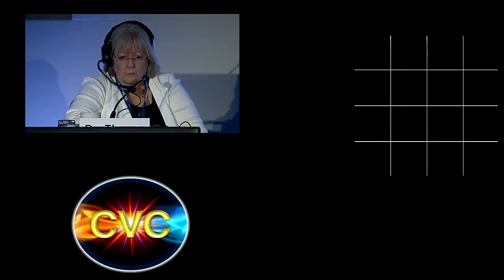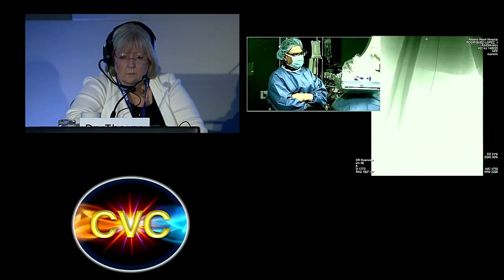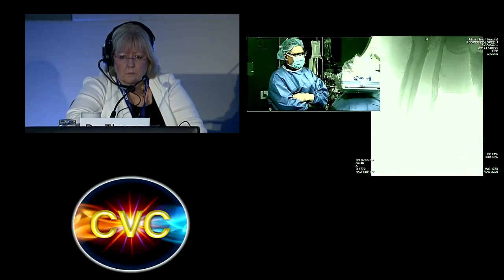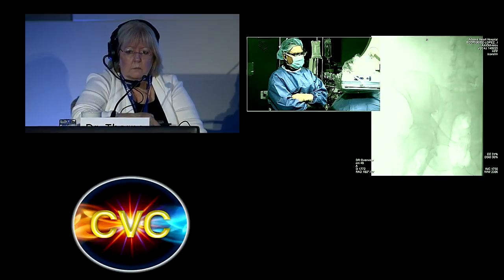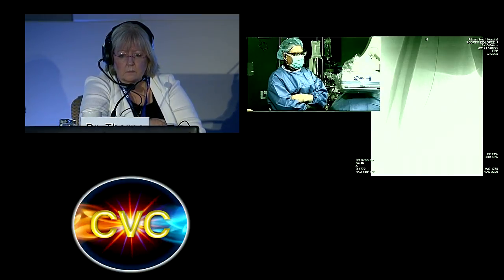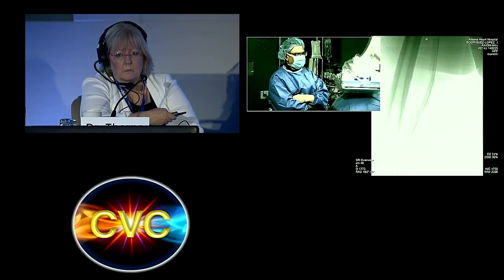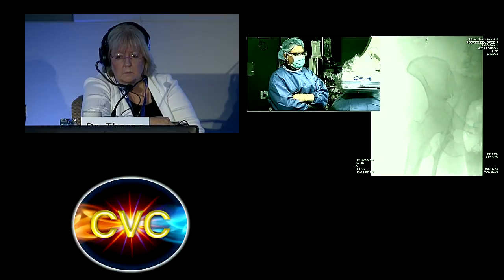While we were waiting here, I decided to do an angiogram. If we can show you the first picture coming up from the popliteal, it's nice to see that the femoral vein actually is well recanalized. And you can see some of the valve is still there with some of the branches and tributaries. However, my wire gets stuck right at the common femoral vein. And beyond that point, we don't see much of a contrast.